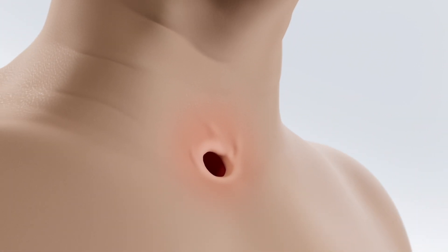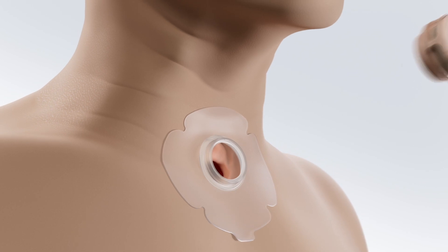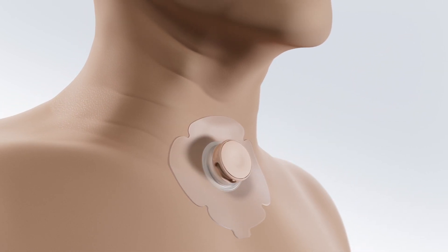Coughing and mucus are some of the challenges experienced post laryngectomy. HMEs are designed to improve lung health, and wearing them can help people with laryngectomy improve quality of life.